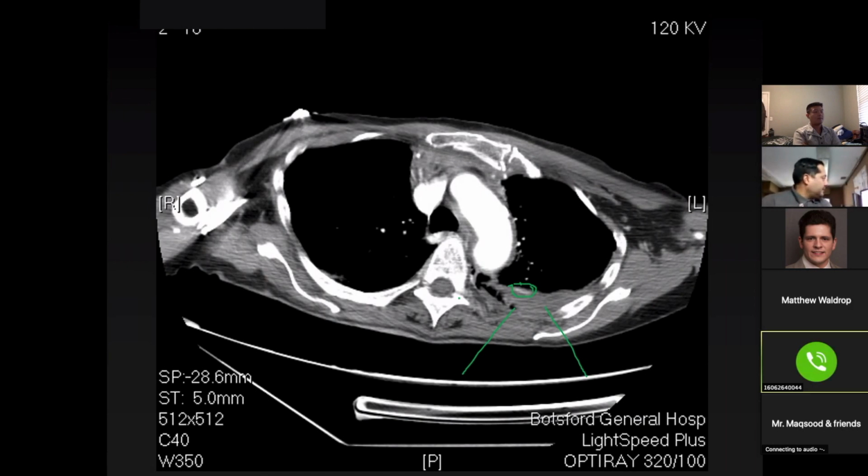Yeah, the mediastinum looks a little abnormal here. Usually you have fat, and this whole mediastinum is much more hyper attenuated. So what does that mean? You are correct. There's hemorrhage, active hemorrhage into the mediastinum, layering in the mediastinum. All of that area encircled should be fatty or dark, like this in the armpit over here, the axilla. So all of that area.